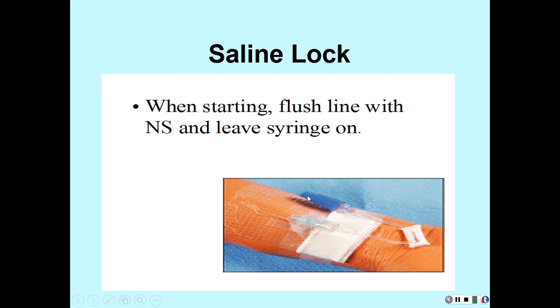Okay. But you have to make sure that not only are you priming your IV line, but you're priming your extension set as well. So usually what we do is we put a syringe on the end of it that has saline in it, squirt saline through it to flush it, and then I just leave the syringe on the end right there and go in and start my IV, hook it up, and then I can flush it.